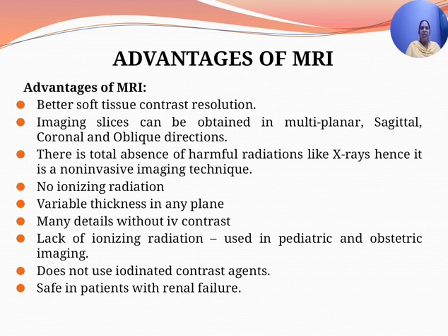The lack of ionizing radiation makes it useful in pediatric and obstetric imaging, for small children. You get many details without IV contrast, with variable thickness in any plane. It does not use iodinated contrast agents, and it is safe in patients with renal failure. These are all the advantages of MRI scan.